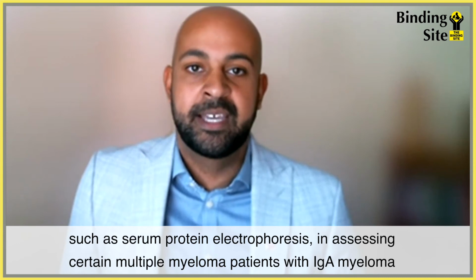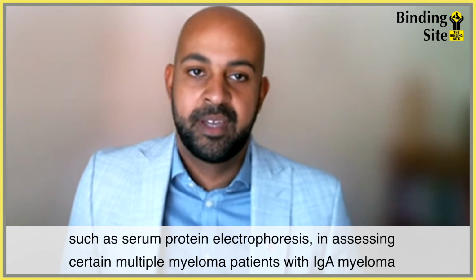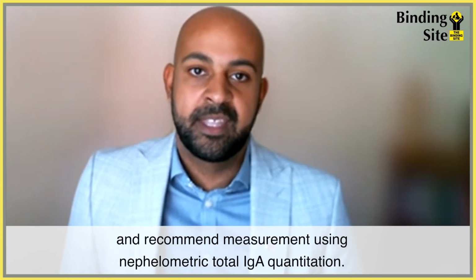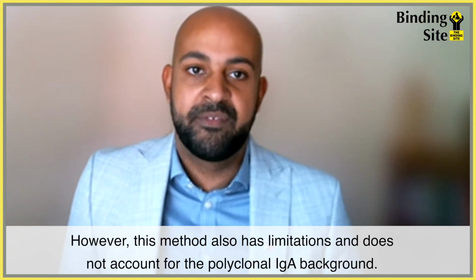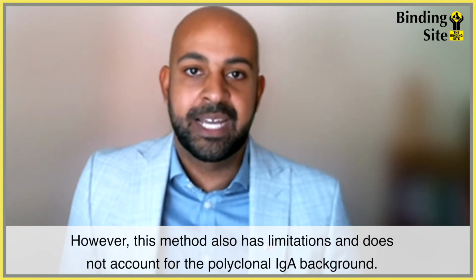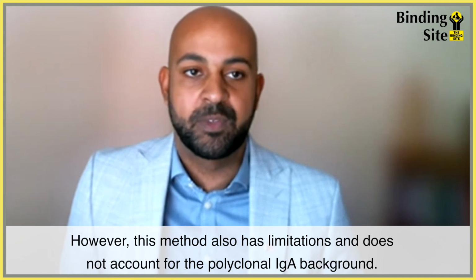The International Myeloma Working Group has recognised the limitation of electrophoretic methods, such as serum protein electrophoresis, in assessing certain multiple myeloma patients with IgA myeloma, and recommend measurement using nephelometric total IgA quantitation. However, this method also has a limitation and does not account for polyclonal IgA background.